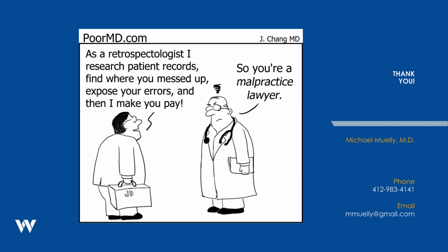You do want to take those images and actually send those images to your PACS system, which is part of the clinical record. So you have this fully documented. Your words in the patient's note may not be sufficient in order to prove that what you're looking at is actually what you think it is.